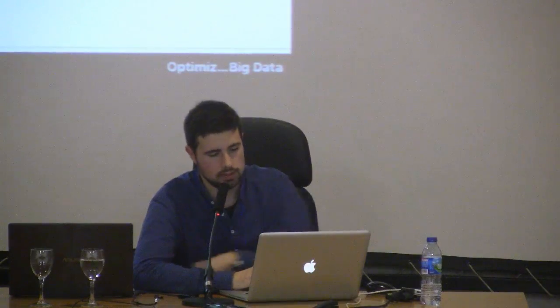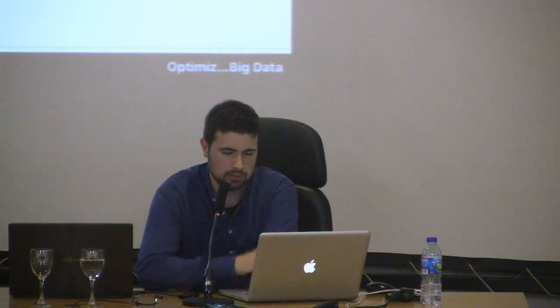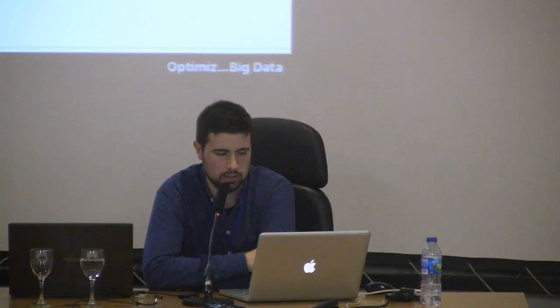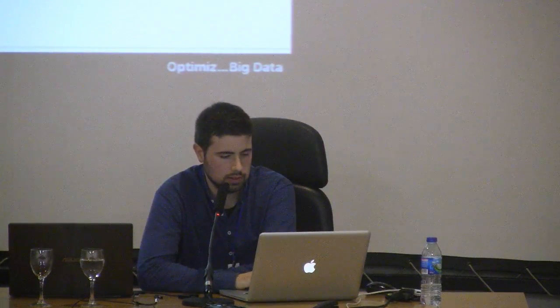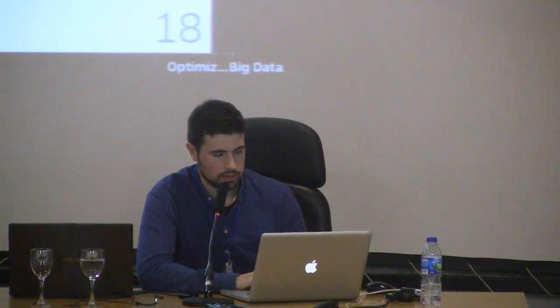So in the end, it's all about automating the processing of all these analyses and making it faster for researchers to just plug in their tools and reach hospitals and other research institutions easily. Here you can see the segmentation. It's basically putting a colored label on different regions in the brain to identify them. In here you can see a kind of heat map of the cortical thickness of different regions of the brain that you can then download as CSV again. So, getting back to the challenge.